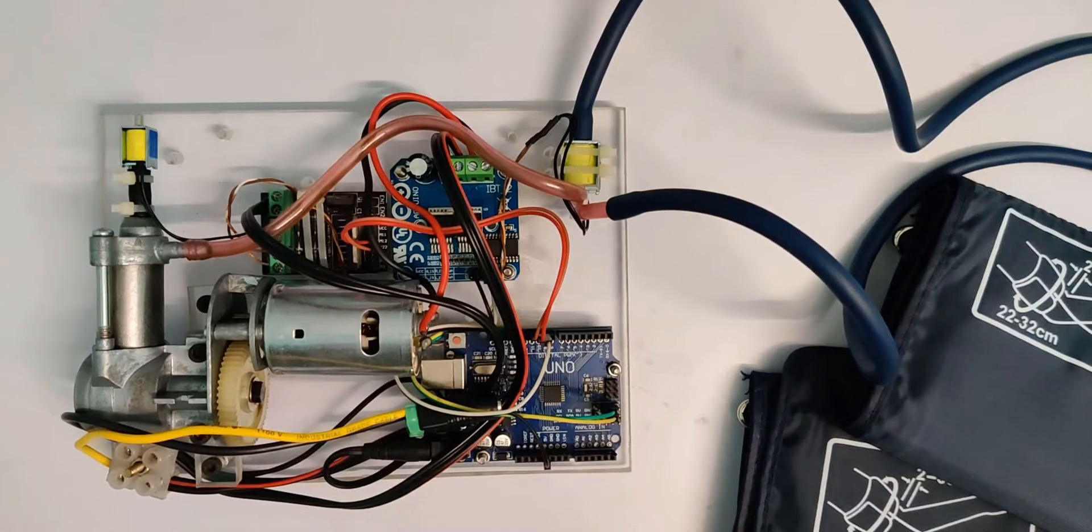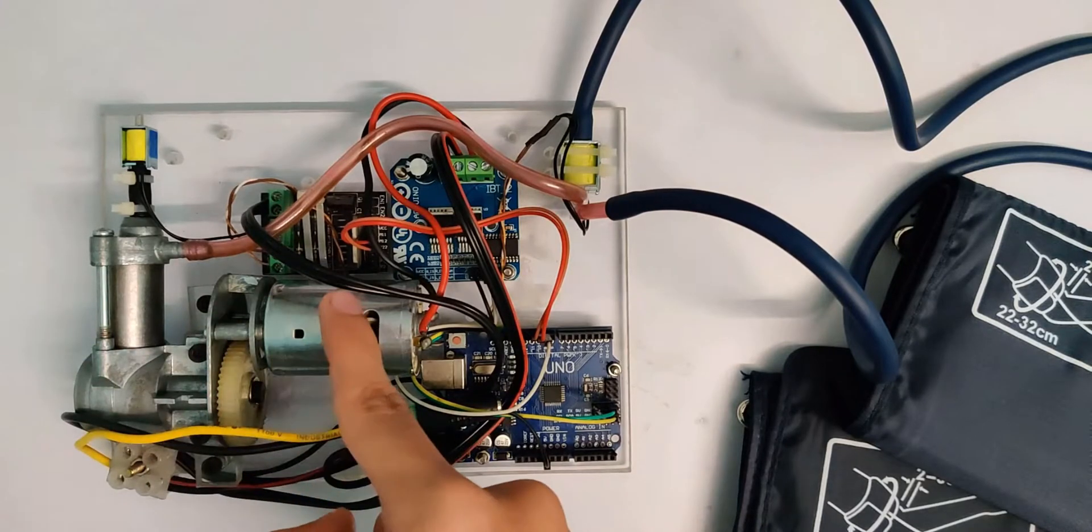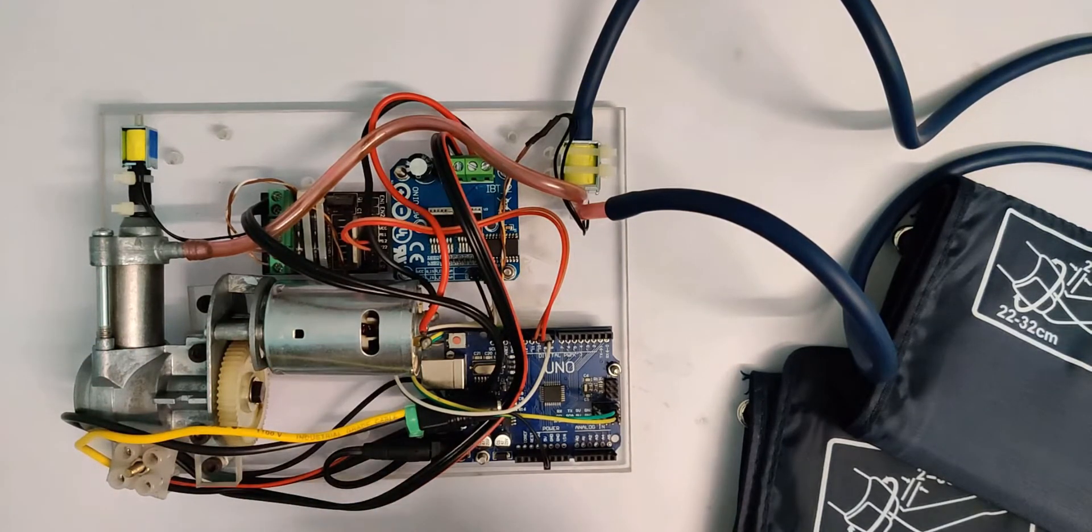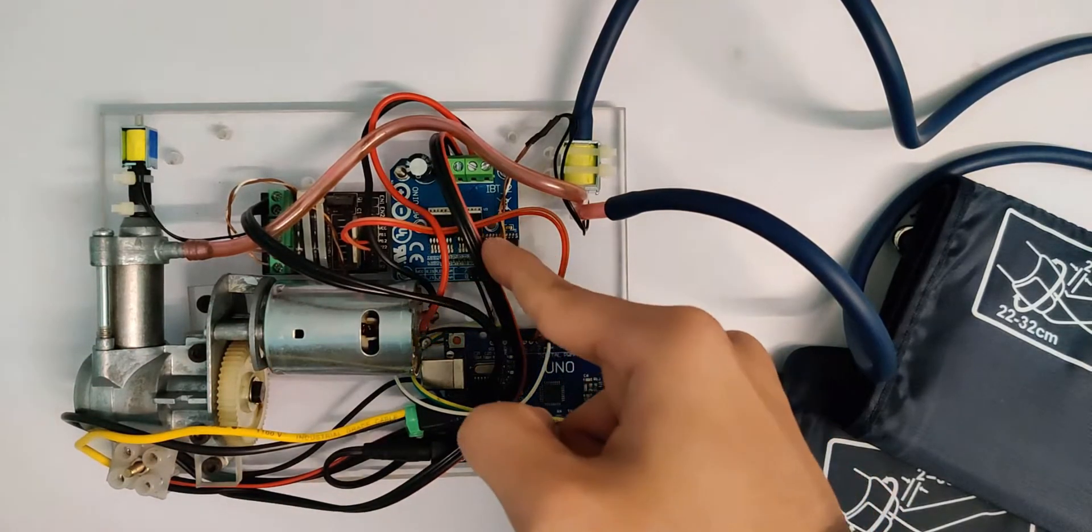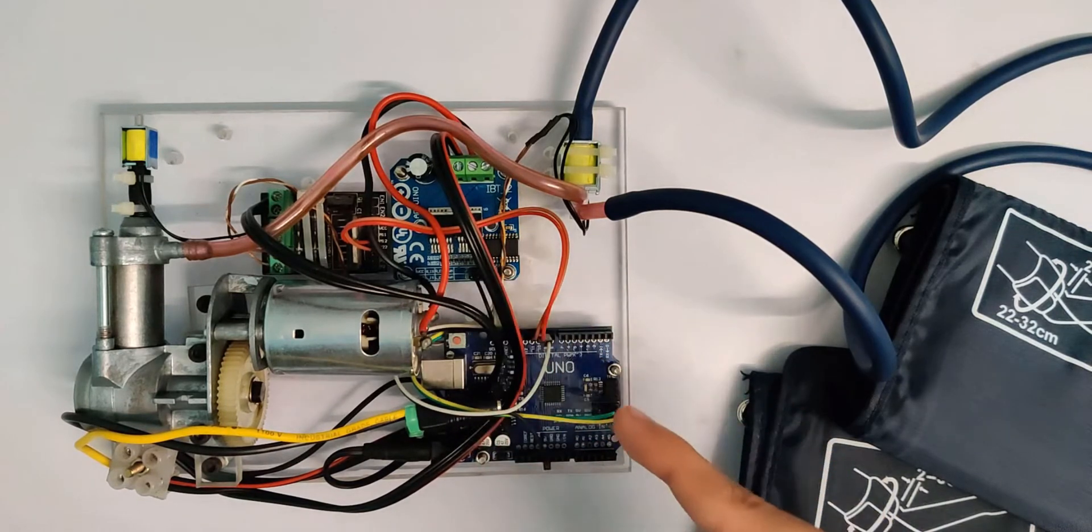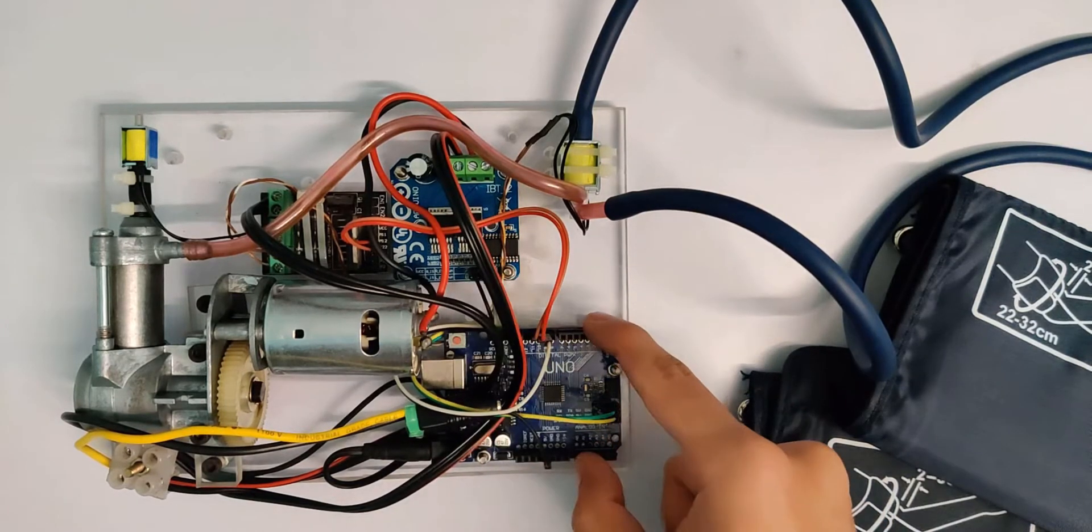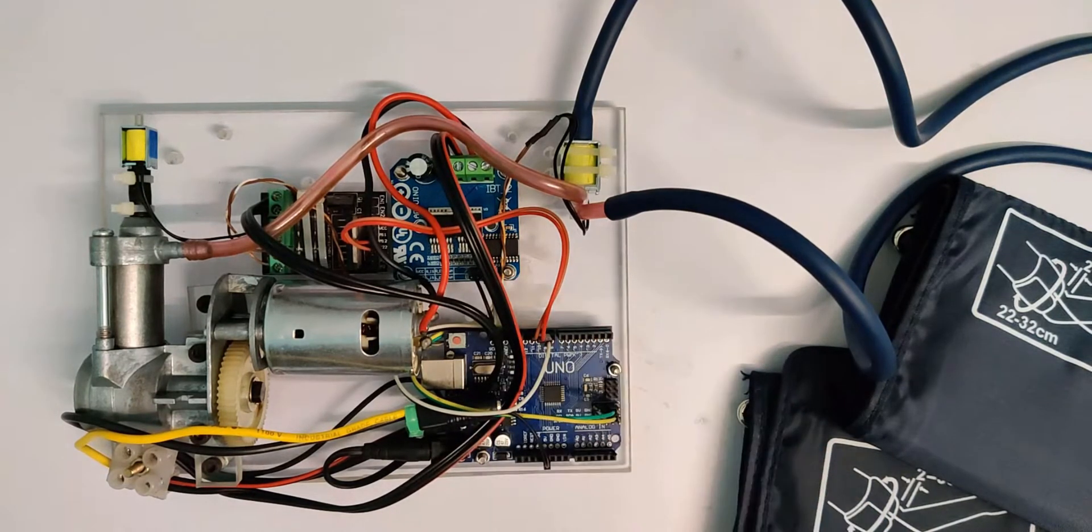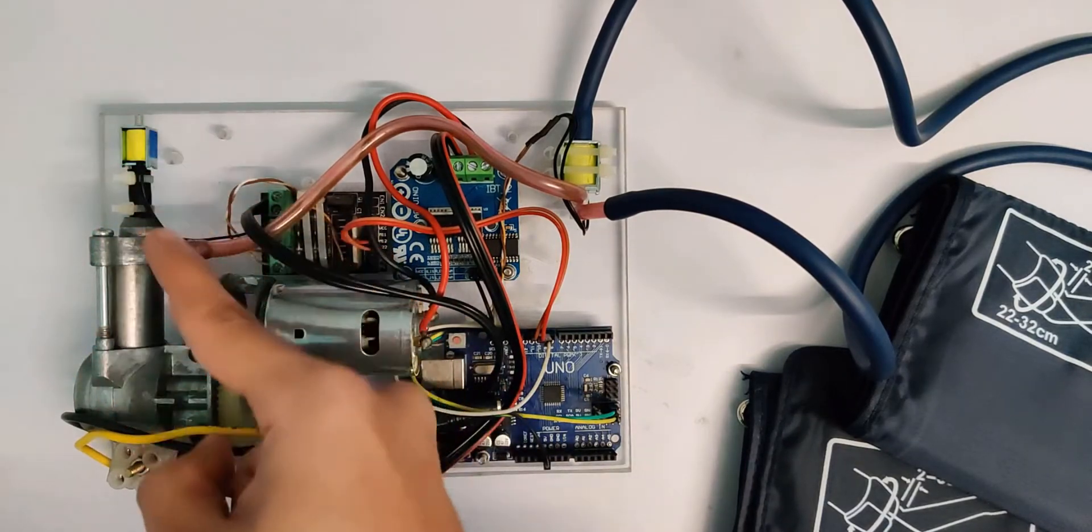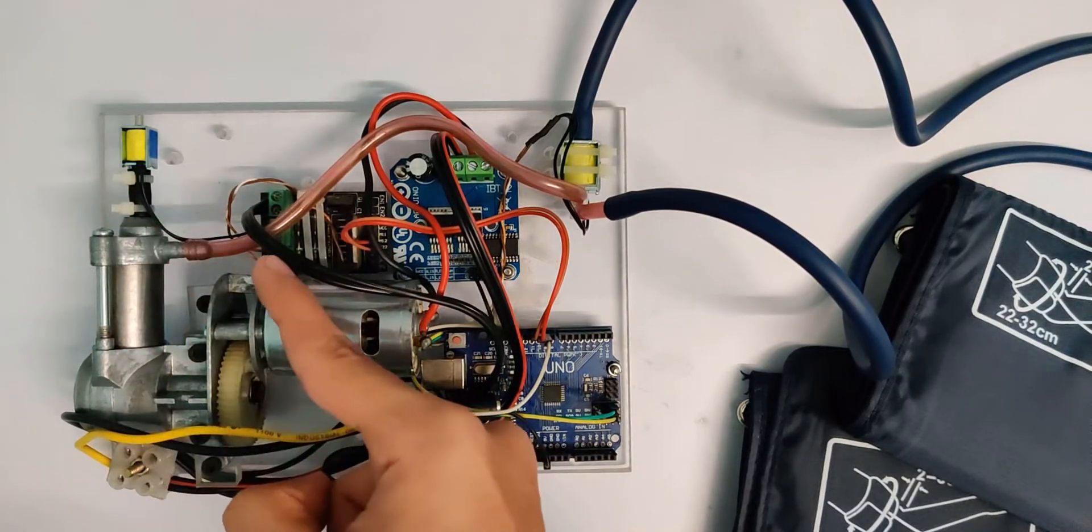So this is the project and here I have an electric air pump which I took out from a car tire inflator. This is attached to this motor driver which is further connected to the Arduino board. The pump has two outlets, one towards the top and one towards the right.